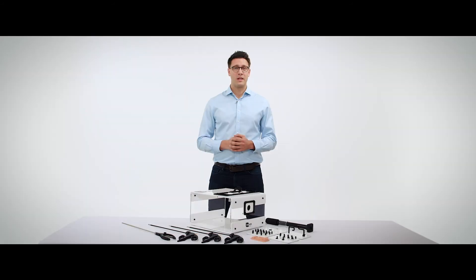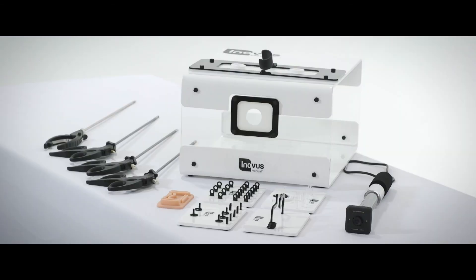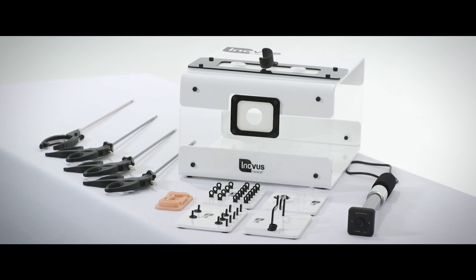By combining the dummy laparoscope, the flat pack nature of the simulator, the basic bases, and four laparoscopic instruments, the Pixis HDMove is not only the most versatile and realistic, but it is also the most affordable, accessible, and functional laparoscopic take-home box trainer on the market.